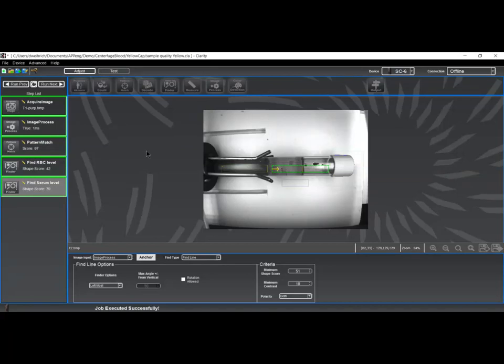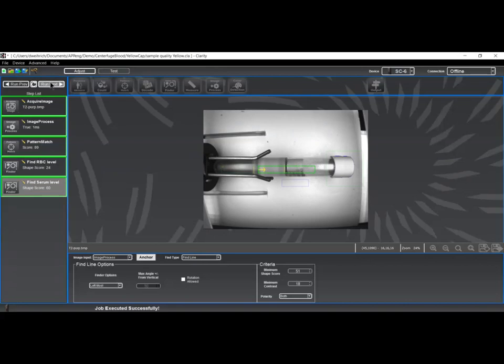Now I'm adding another level determination sequence. This time I'm finding the top of the serum level. This is an important parameter for the sake of measuring the distance between these two, and also for locking the color measurement portion to some feature that is deterministic for the area that you're going to be measuring. Again, I've worked through some of the parameters that get me the most consistent performance across all of my samples.